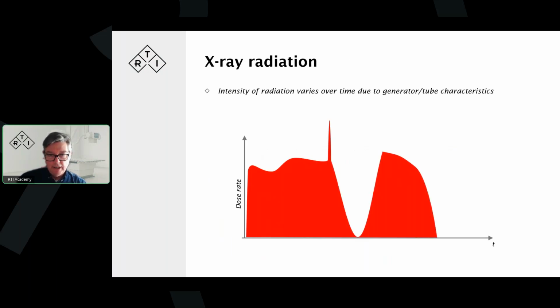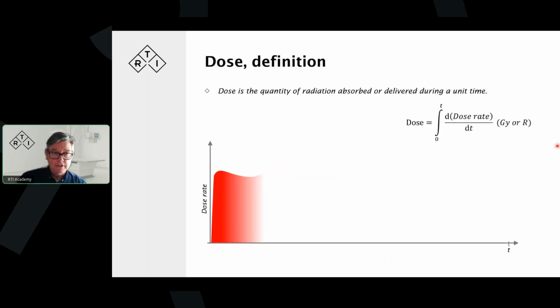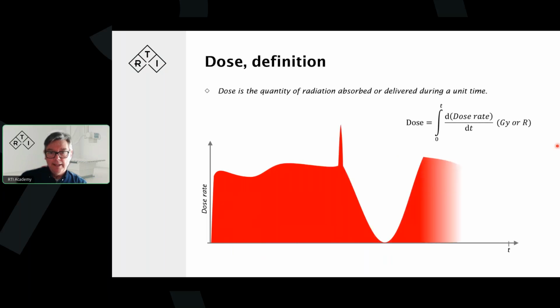If we have a level of radiation that fluctuates like this, for some reason, and we have a small spike here, something that just happens here, if you have a slow system, it may not pick that up because it's too quick. It'll just make a small bump.